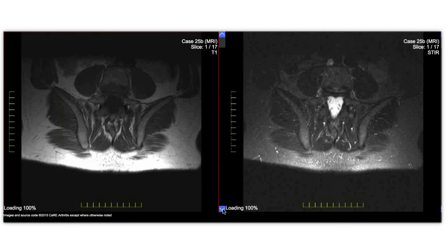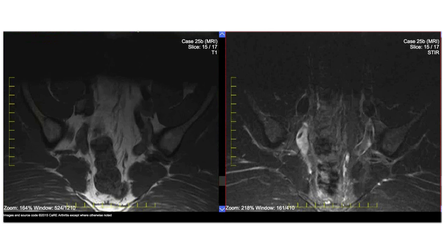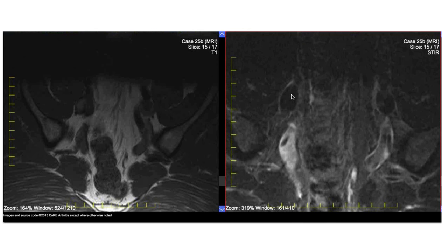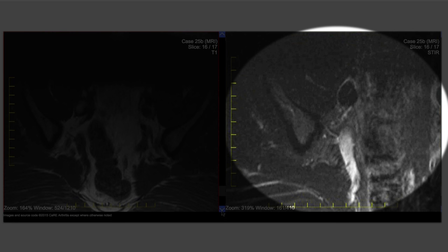This is what I want to show you — some of the remarkable capabilities of the DICOM software. I can move the image around and zoom into areas of interest.